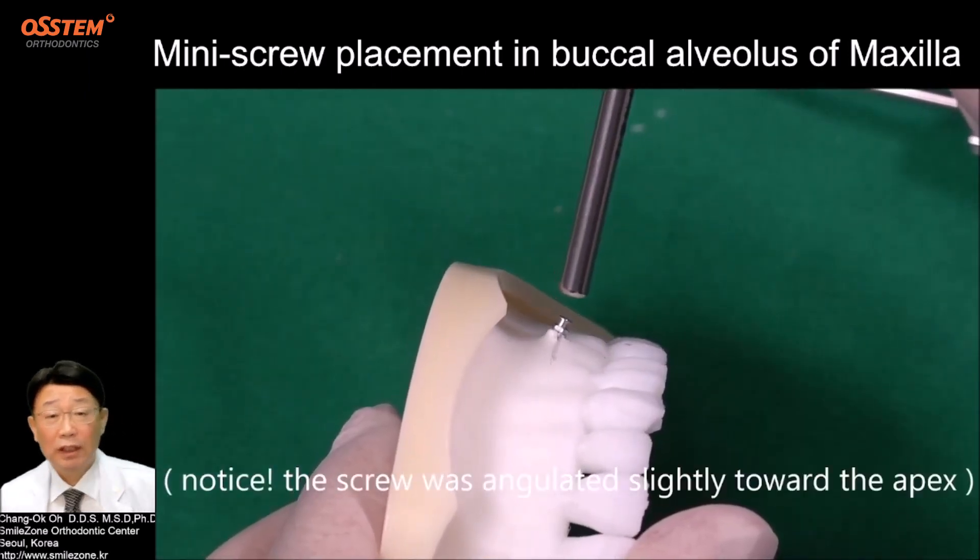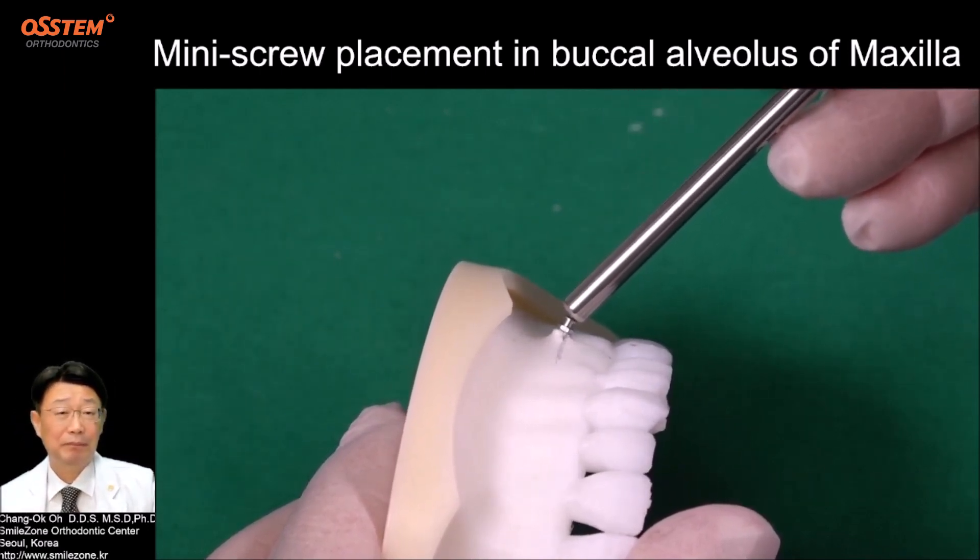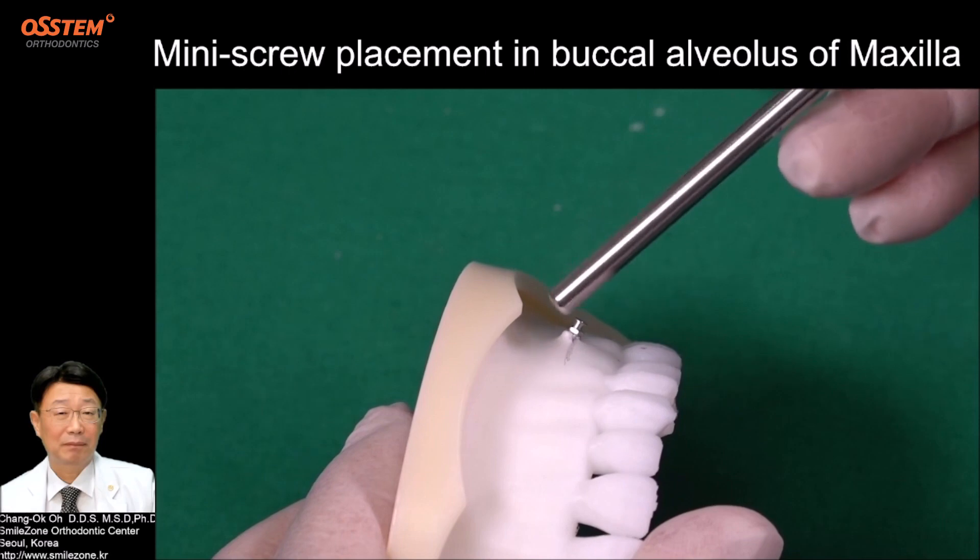Notice the screw was angulated slightly toward the apex.